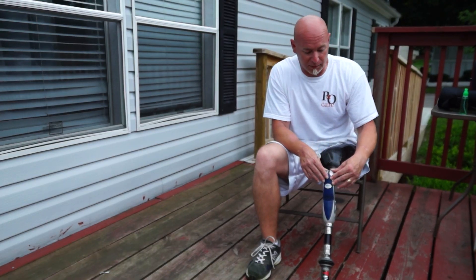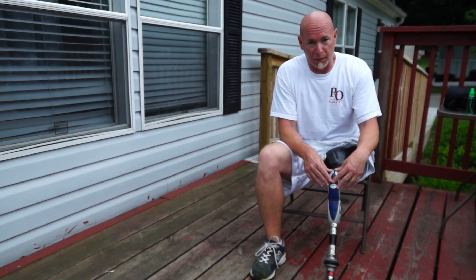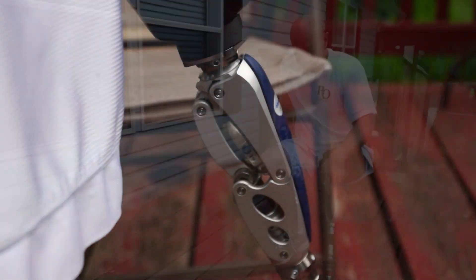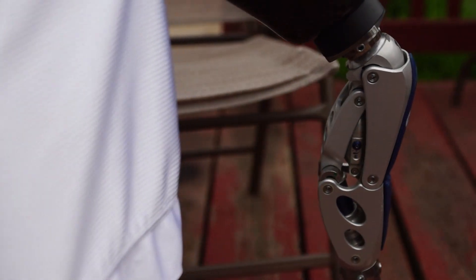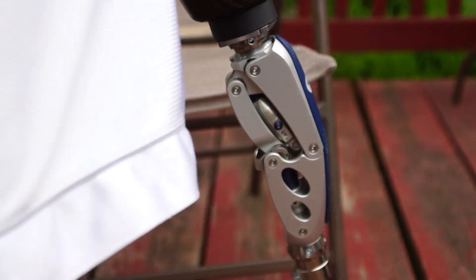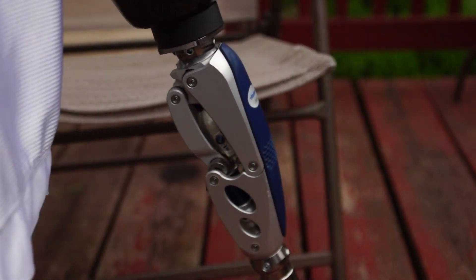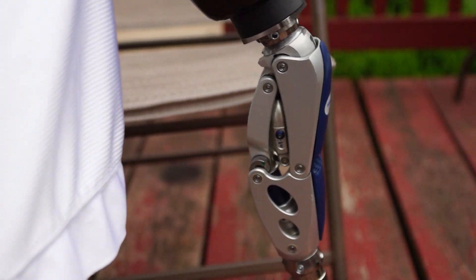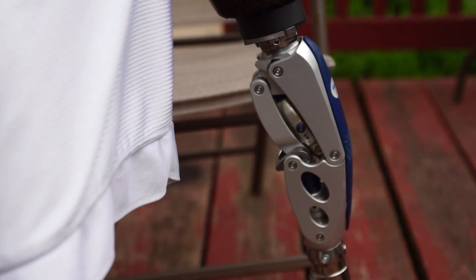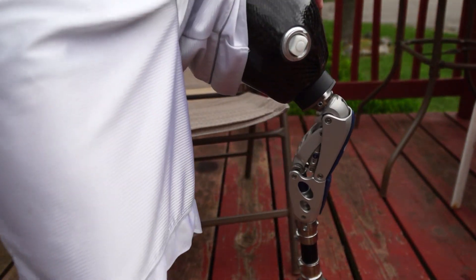When we go into the stance flexion, that helps me go down hills because I can plant my heel and when I plant my heel it goes in and locks the knee. The tab when it's down lets the knee bend, and then when I'm at stance flexion you can see the tab flip out and that locks the knee. That way when I'm walking downhill I can plant my heel, go into stance flexion, and it will take me to my next step without having to worry about the knee buckling.